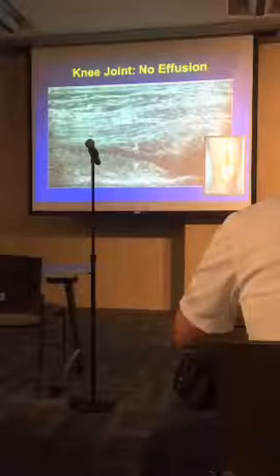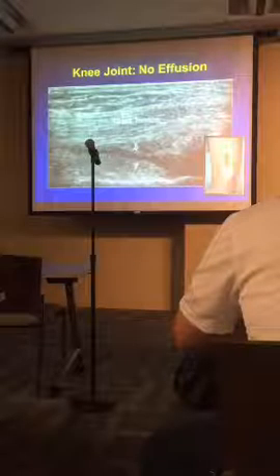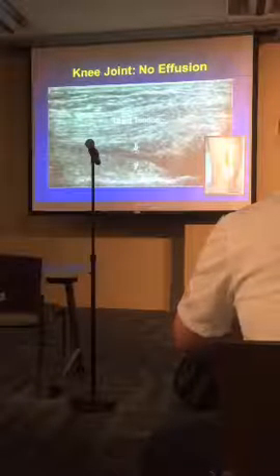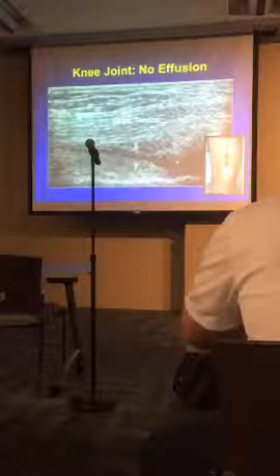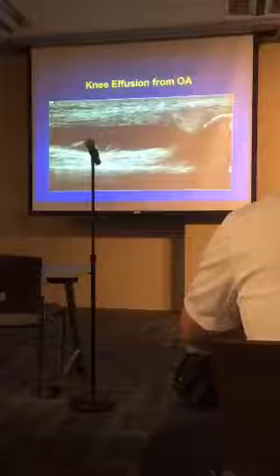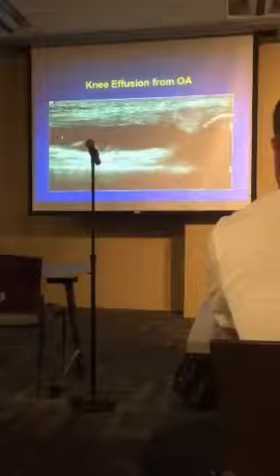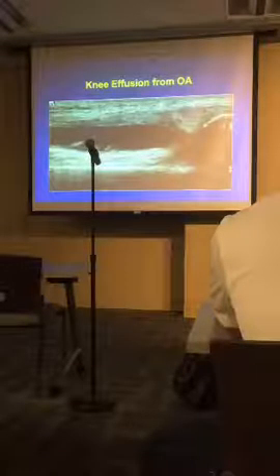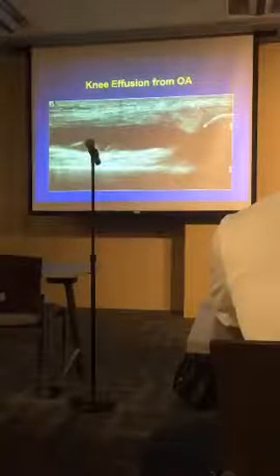For the knee, the probe is placed suprapatellarly. You see the quadriceps tendon and two fat pads — the suprapatellar and pre-femoral fat — with an oblique line between them representing the potential space of the normal knee joint. When that fills with fluid, you get an effusion: in a patient with osteoarthritis, a lot of fluid with some debris can be seen, with the fat pads split by the effusion and the extensor mechanism in front.